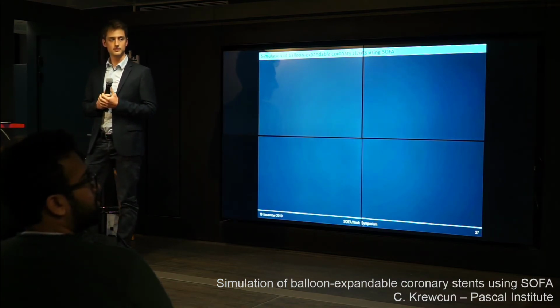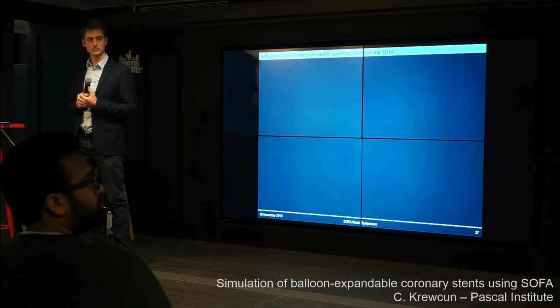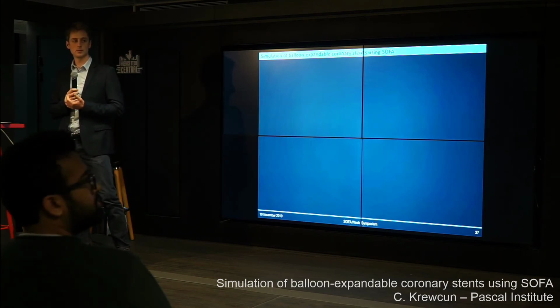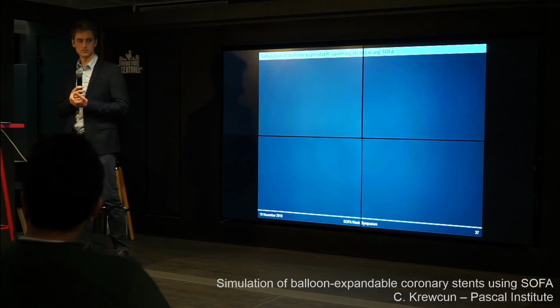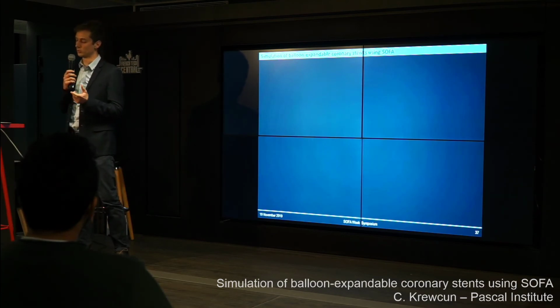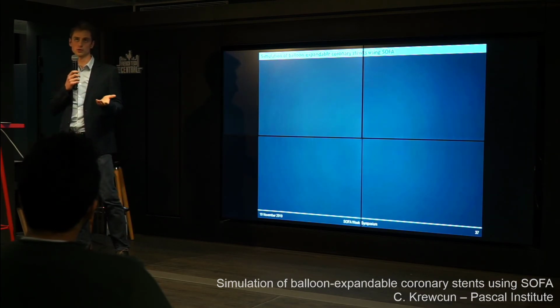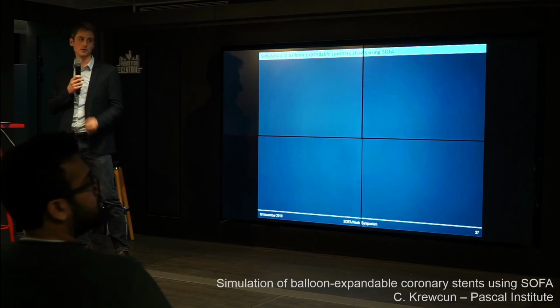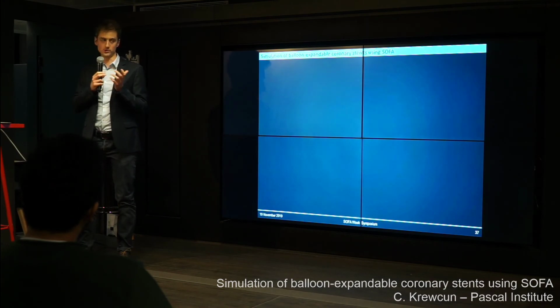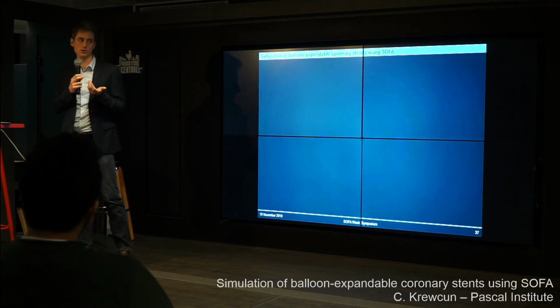In the video, I think you mentioned that the blood vessel surrounding the stent is actually deformable. Here, the deformation is very small in that case. The stent comes in collision and puts pressure on the blood vessel, which is moving a bit less than a millimeter. What happened here is that in the experiment we expanded a stent whose nominal diameter was 3 millimeters in a 3 millimeter diameter artery. So there is a slight contact, but afterwards the deformation of the artery remains very minimal.